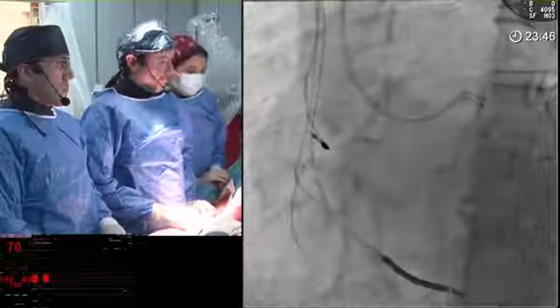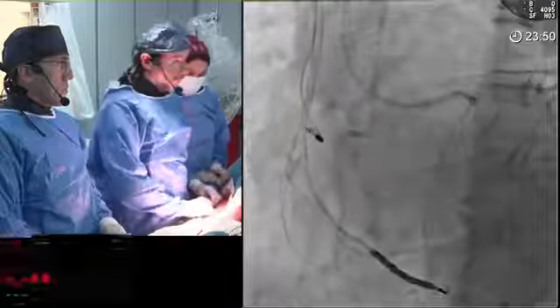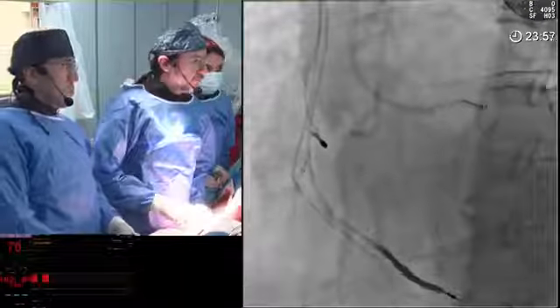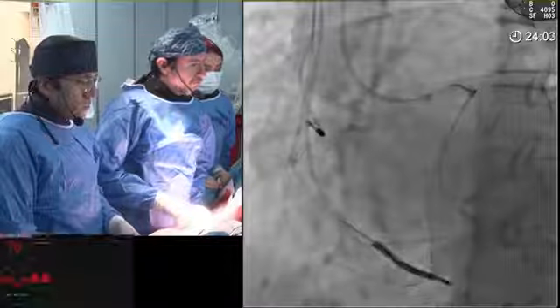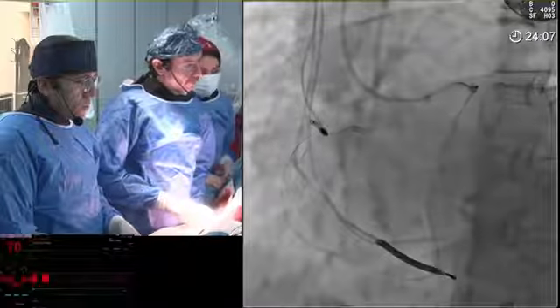Because at this point, you can exit the vessel structure because you don't know where the vessel is. And the only way to know it here is with a knuckle or with an injection. Antegrade, they have to bail out of this, go femoral and get a larger French catheter there, because that's unlikely to work this way.